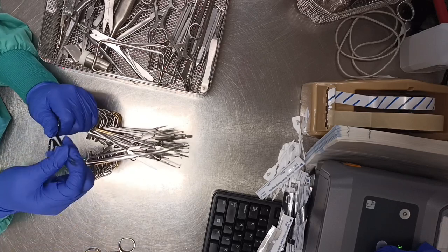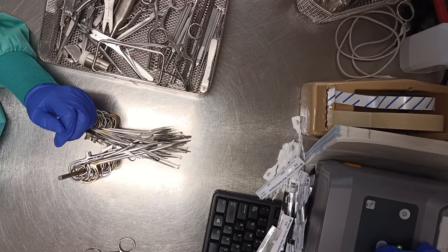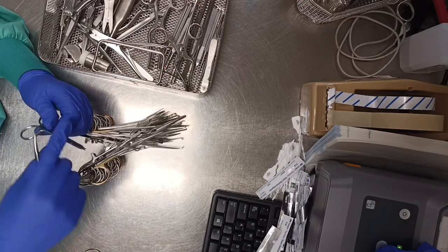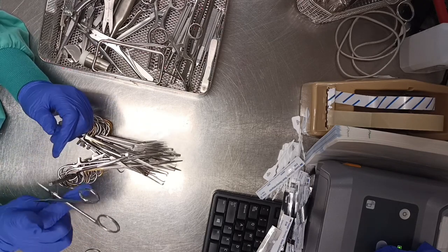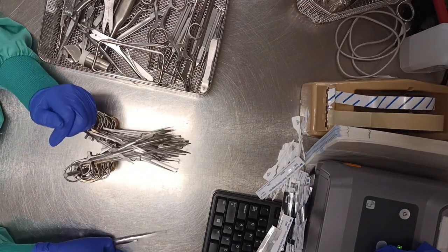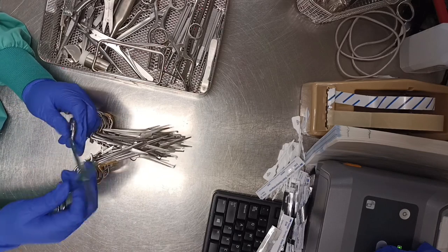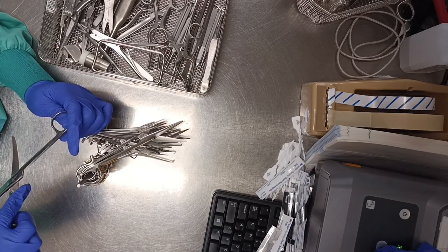And then the other instrument I just put in was a Metz scissors, 5-inch. And then this one is a tenotomy. I just put in a tenotomy curved, and I'm going to be putting in an iris curved and an iris straight. So I'm just going in, looking through the instruments as usual, making sure everything is clean. And that right there is a straight Mayo, the straight Mayo, and this is the curved Mayo.